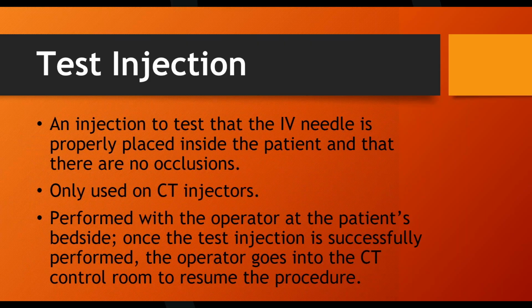Now, CT and MR injections are done through, like I said, an IV needle. A lot of times the patient will show up from ER or ED already with the IV needle in them. Or when they get there, if they don't, they need to put the IV needle in themselves. To make sure that we actually got the needle in the vein and we didn't just plunge it into soft tissue, before I go shooting this first phase here of 50 milliliters of fluid, let's make sure we actually got in the vein.